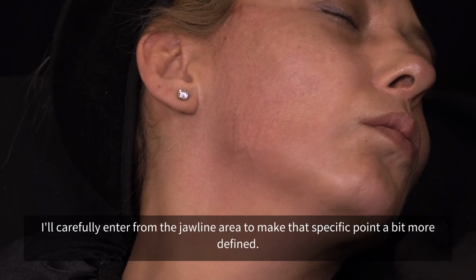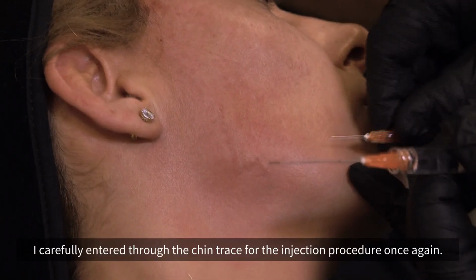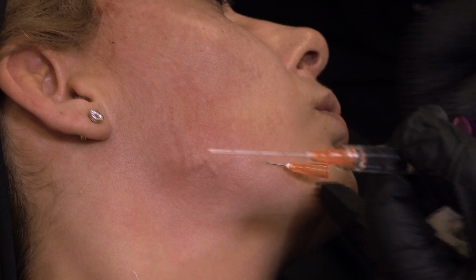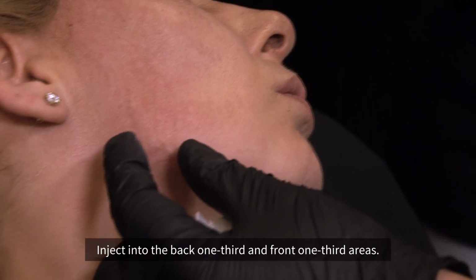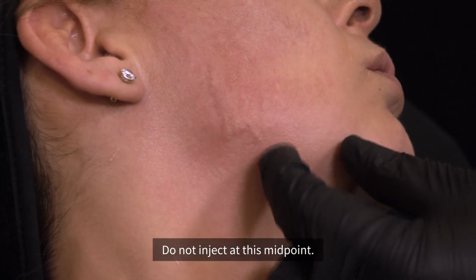I'll carefully enter from the jawline area to make that specific point a bit more defined. I carefully entered through the chin trace for the injection procedure once again. In these injections, dear friends, you should avoid injecting into the middle 1/3 area completely. Inject into the back 1/3 and front 1/3 areas. Do not inject at this midpoint.